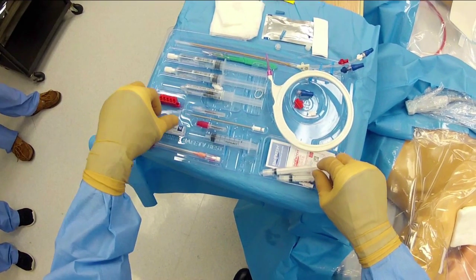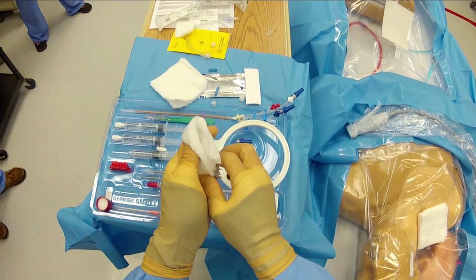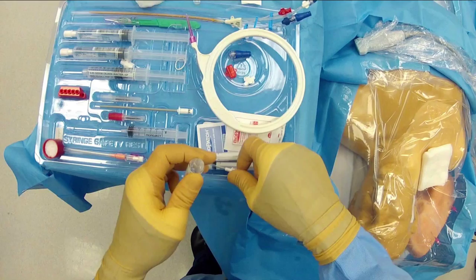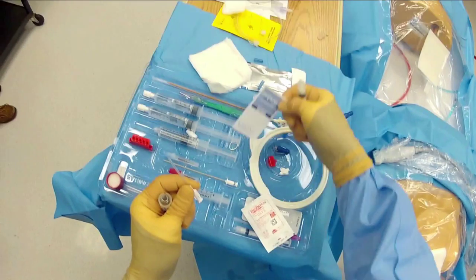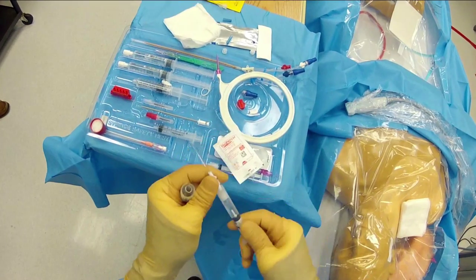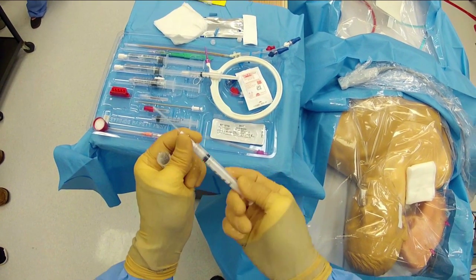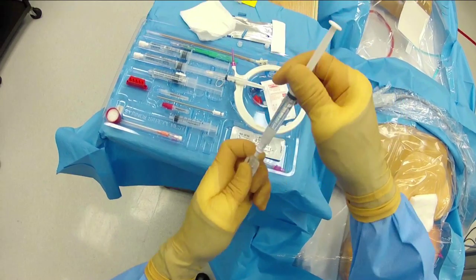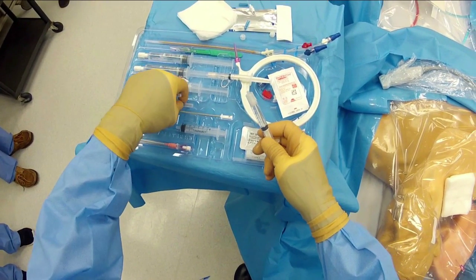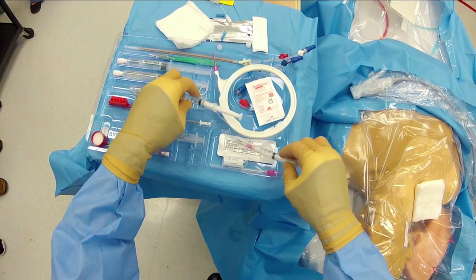Now we prepare the lidocaine. We take the glass ampoule, swirl it to get the air bubbles out, and crack the top with a 4x4 — the 4x4 protects against any glass shards if the ampoule shatters. We take the lidocaine syringe and the filter straw, which replaces the filter needle and has no sharp end. Using the filter straw we draw up the lidocaine and evacuate the air. We fill both lidocaine syringes: one with a little more for soft tissue anesthesia during central line placement, and one with a little for suture anesthesia. We have a longer needle for the procedure lidocaine and a shorter one just to numb the subcutaneous tissues for suture placement.